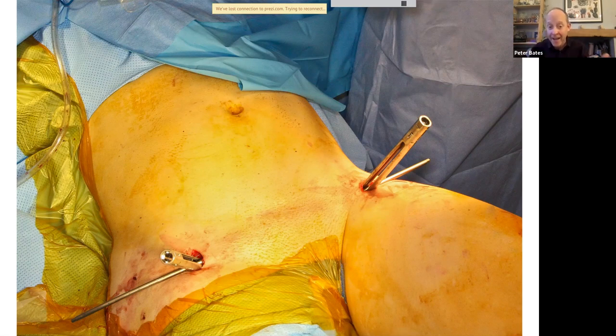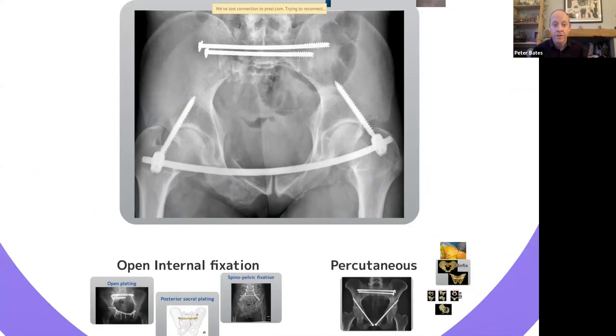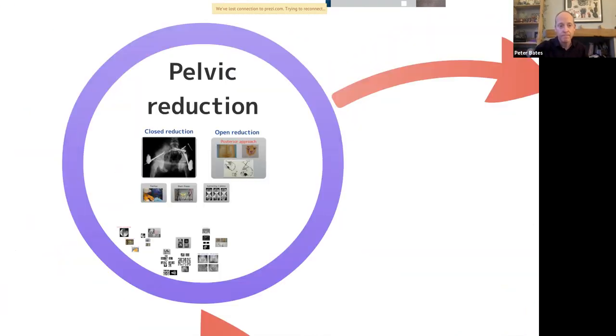So it's basically like an X-fix, isn't it? A bit like the X-fix I showed you earlier, except you don't get all those pin site problems because it's all buried underneath the skin. Those two turrets that are sticking out get taken off at the end of the operation, and you just end up with something that looks a bit like that. So you've got this bar sitting under the skin and the two screws going to the pelvis. Honestly, in most young patients, we take them out, but it stabilizes the pelvis really well with the screws at the back as well. So that's all percutaneous, in other words, minimally invasive pelvic surgery.